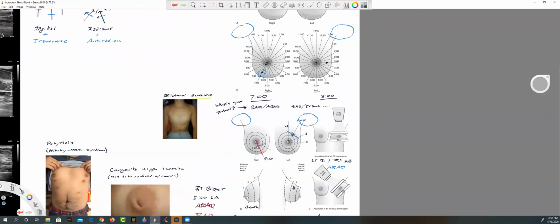it's like all this, image here, a full exam, and then axilla added on. Just like this long list over here.